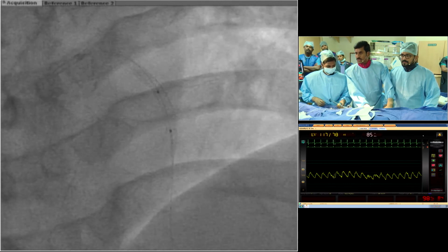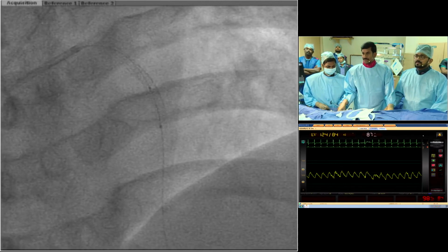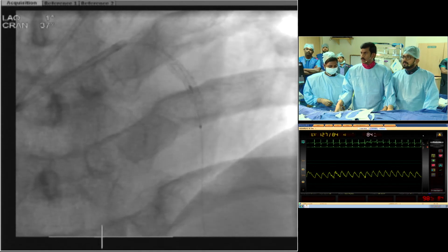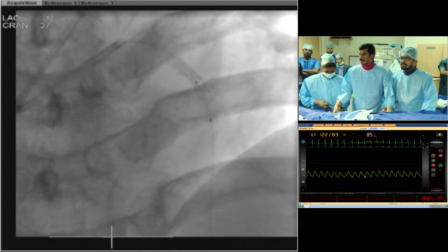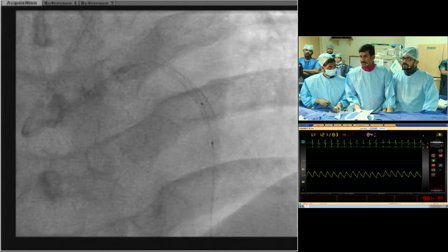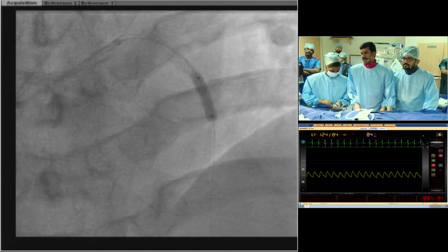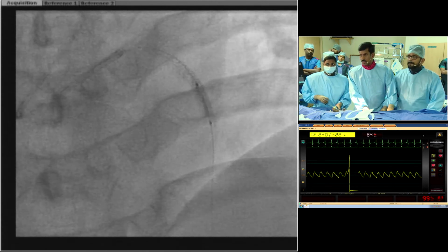And have a stent boost. The stent boost shows I think we are in the right place. Gentle inflation, 10 atmospheres. Here actually the vessel is only 2.6 or so. Deflate. So we didn't want to go higher up there.